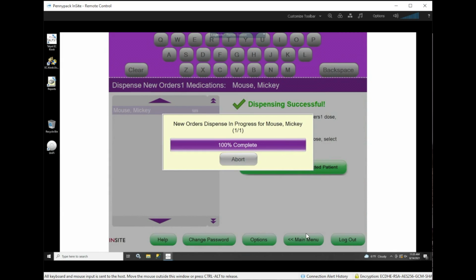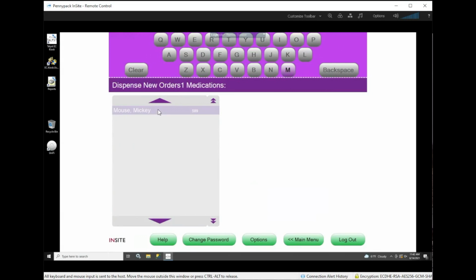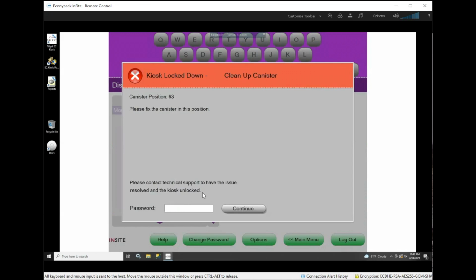Now, in this next example, what we're going to show you is when you go to dispense medications and you run into what's called a kiosk lockdown. Now, kiosk lockdown is basically a jam in the canister, but it's a jam in the base as well. So this usually happens with larger pills and tablets such as potassium 20. The tablets get caught in the base that holds the canister.